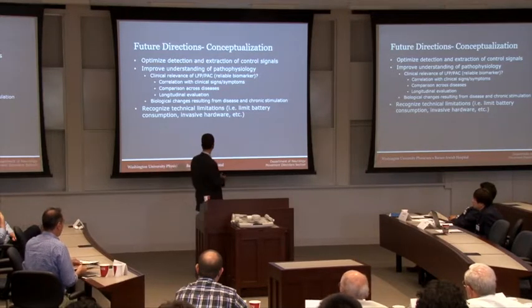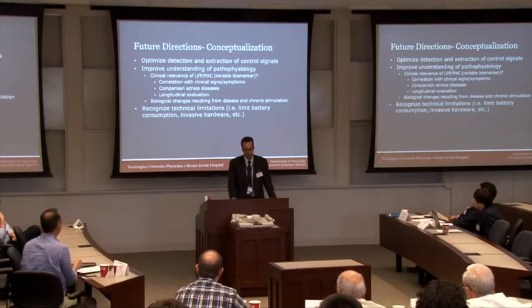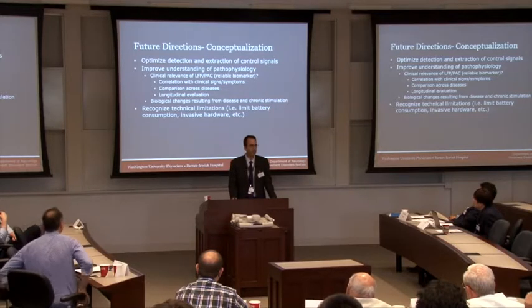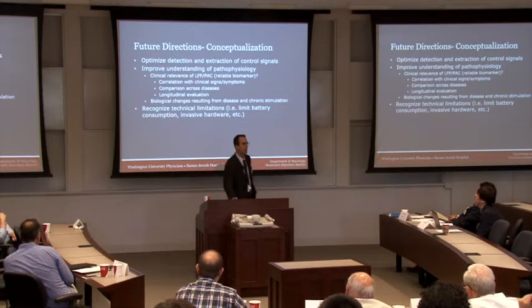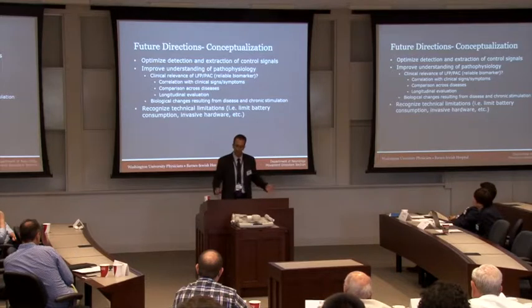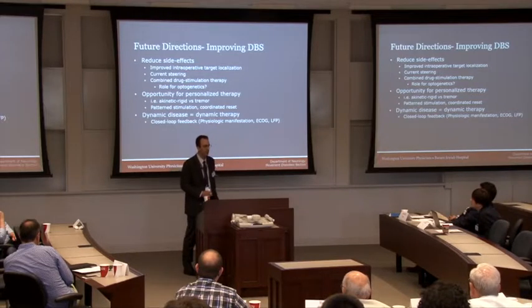And then I think folks have already mentioned, our early speaker mentioned the technical limitations. There's cost associated with all this, cost to us as researchers, cost to the patients themselves, and we need to recognize that. We need to recognize that there are limitations in our technology with current battery stimulation. We certainly don't want patients walking around with devices and wires and antennas and those types of things that are affecting their activities of daily living. So people are working on improving technology, and those are important concepts, but we need to remember that when we're treating patients.